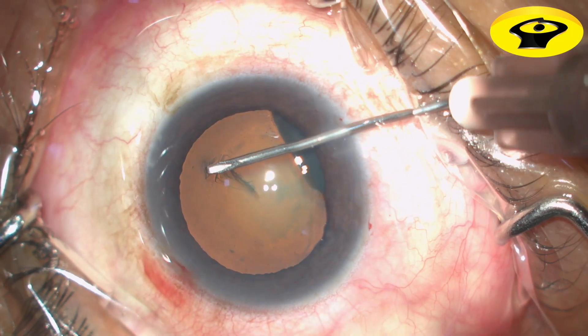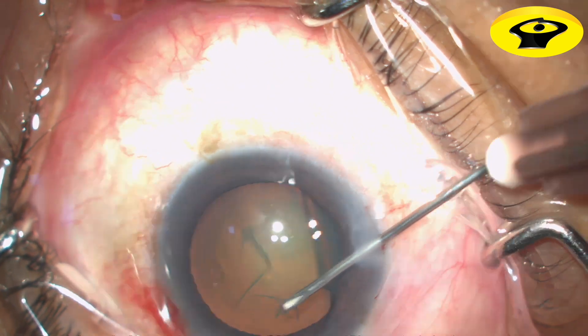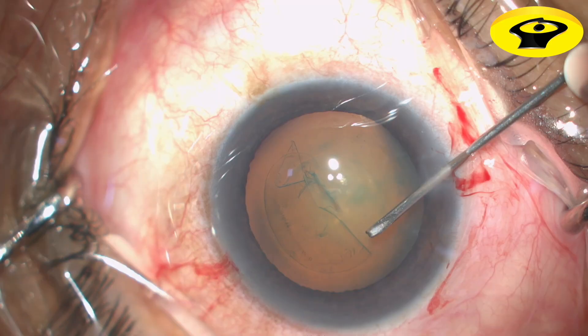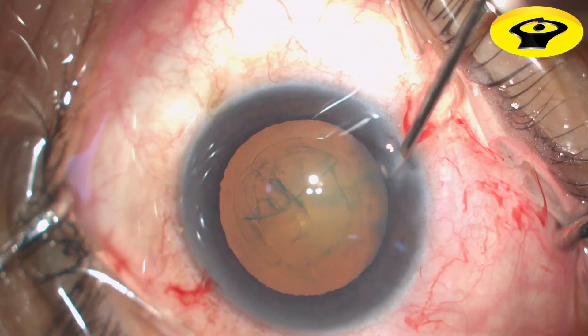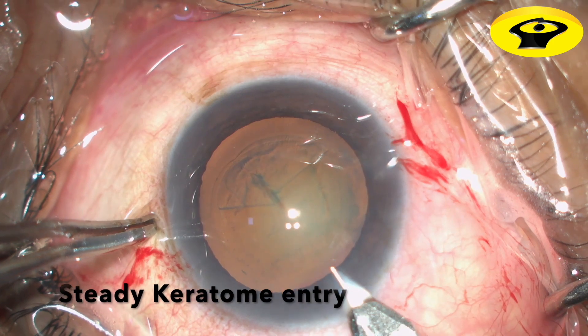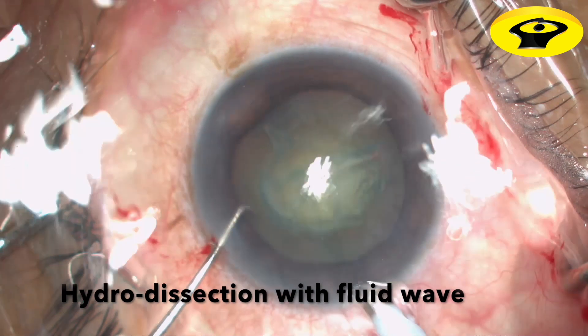The term Divide and Conquer was first proposed by Dr. Howard Gimbel, which claims the phase of the phacoemulsification — be it the 4-quadrant Divide and Conquer, horizontal or vertical chopping — all have one thing in common: they create a cleavage plane that allows the surgeon to disassemble the nucleus into smaller fragments.